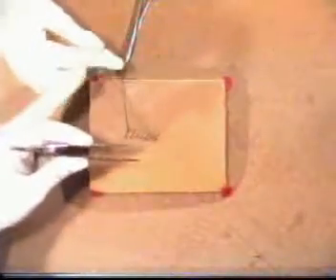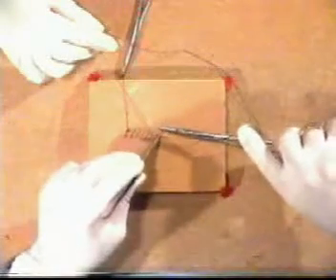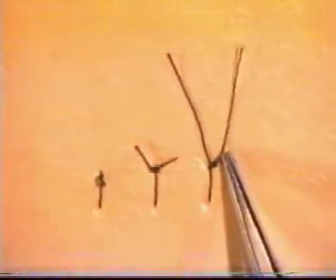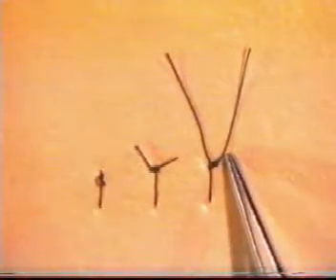Pass it again to your assistant, who will be wary for the rest of the operation. When cutting sutures, do not cut them too long, as this long length of thread will be a needless waste of suture material, and will get caught up in the wound or in the dressings.